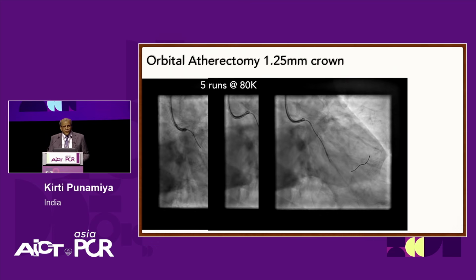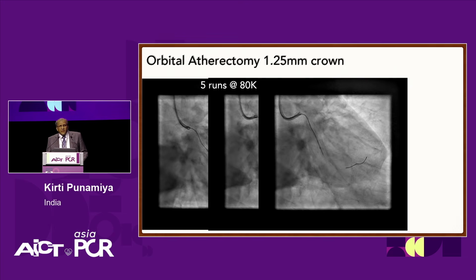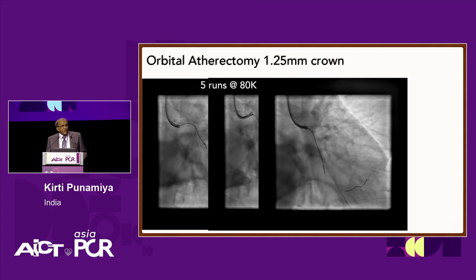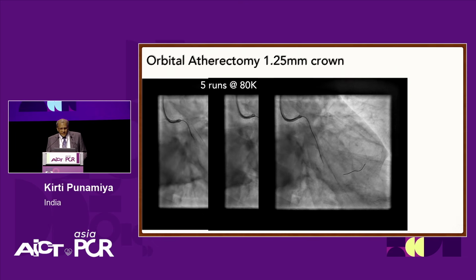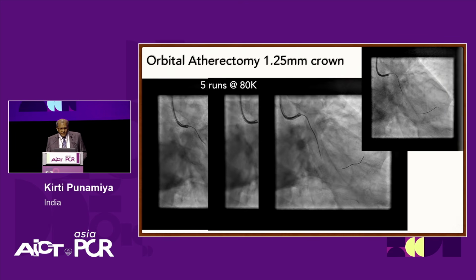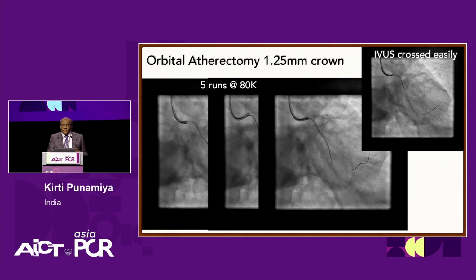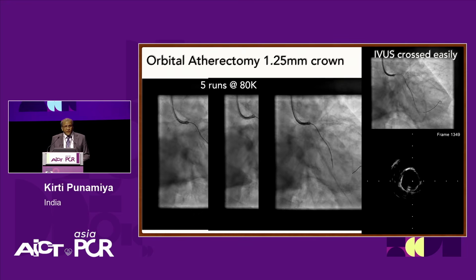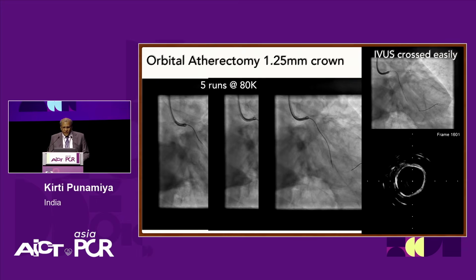It has an advantage over rotational atherectomy because in these bendy circumflex arteries, as shown by Jackie, you could avoid the nightmare of a stuck burr, and this is a great technology for that. Of course, then the IVUS catheter goes. So we've done the crossability. We've been able to get a crossable IVUS catheter there, which allows us to go into imaging, which tells us there's a diffuse, long calcified lesion there from this run.